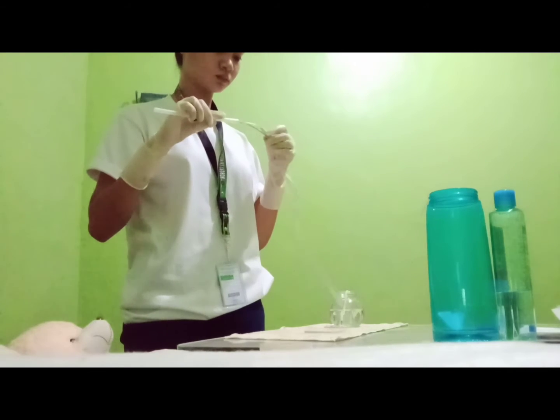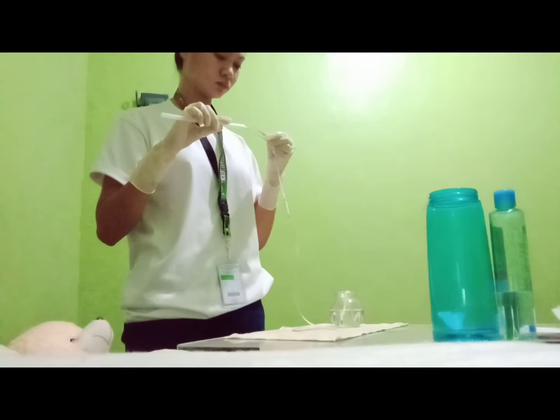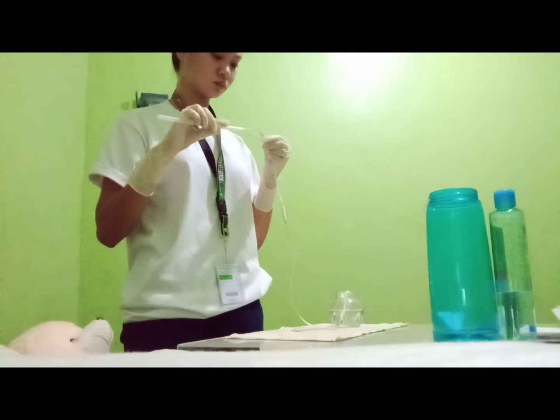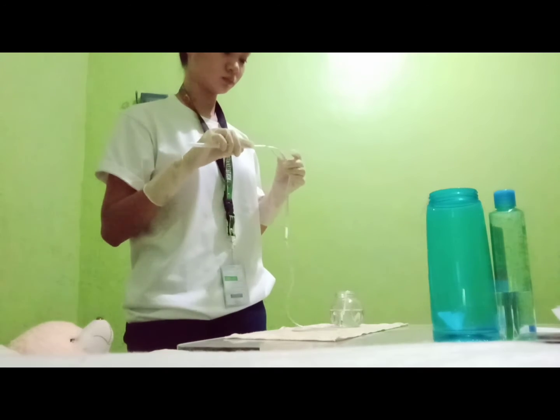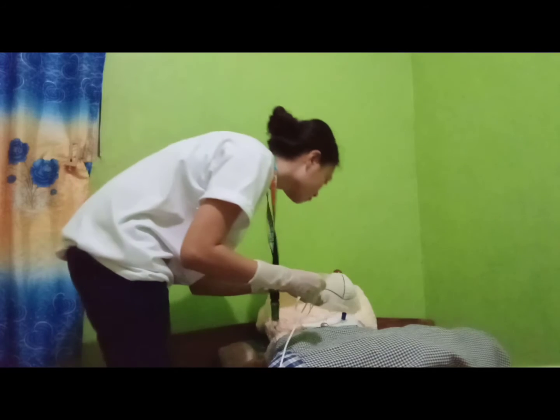Test functioning of equipment by applying thumb from non-dominant hand over open port to create suction. Lubrication makes catheter insertion easier and ensures proper functioning of suction equipment.